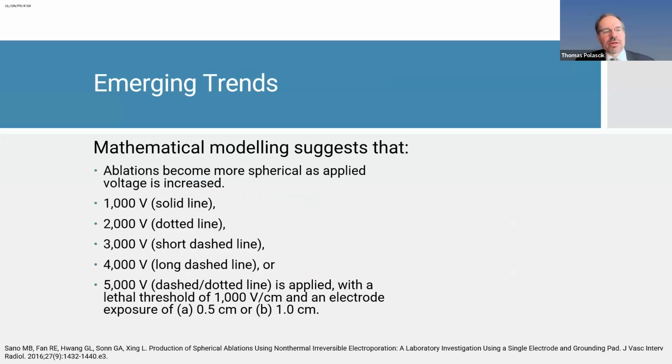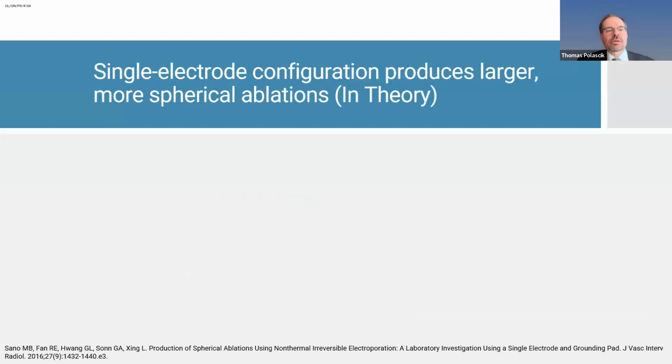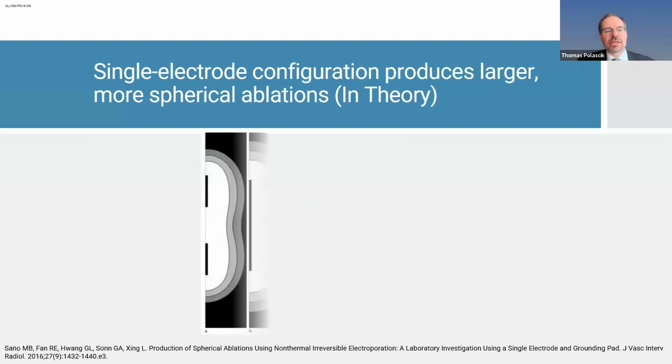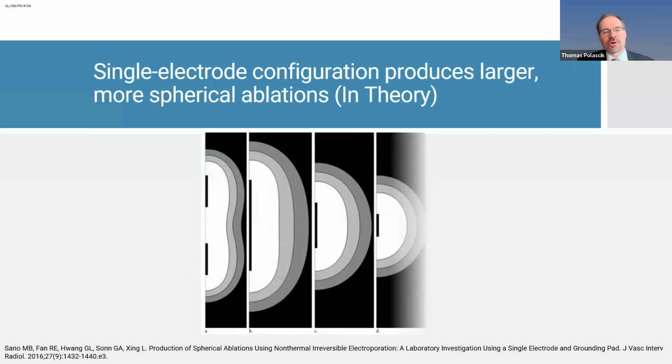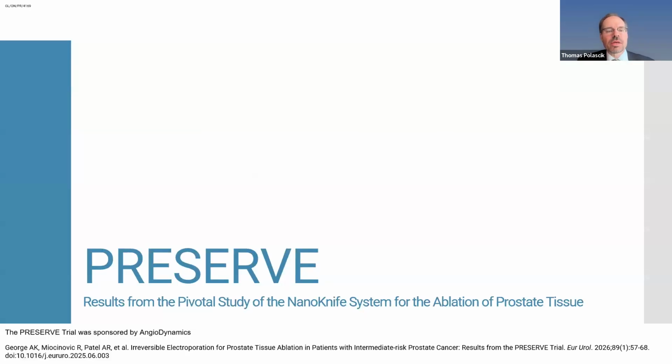And this is all shown by mathematical modeling. Basically, the more energy you apply, these lesions get more spherical. And you can see this in the cartoons. As you apply more energy, these lesions become more spherical.